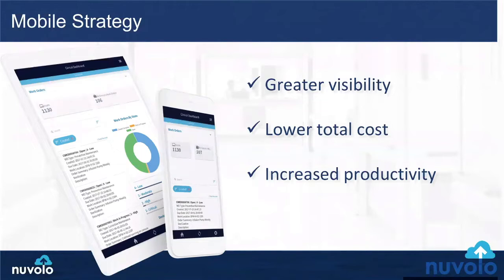And this causes at least two problems. The first thing that we notice right off the bat is that it's double the work, right? So we see that they're writing down their notes and then they have to do that all over again in the CMMS. And because they might not get to it right away, we also see a lack of data reliability in this because this process in and of itself is prone to error, right? So we're translating our handwritten notes incorrectly in some cases. Maybe we just can't read what we wrote down before because it was a quick scribble, or even just forgetting to write something down in the first place.